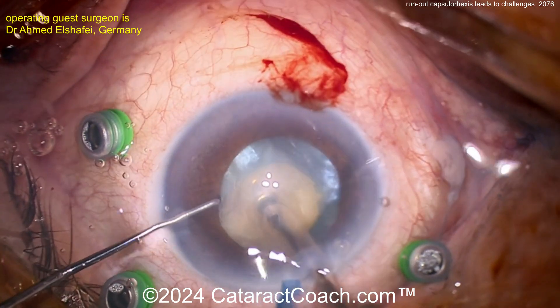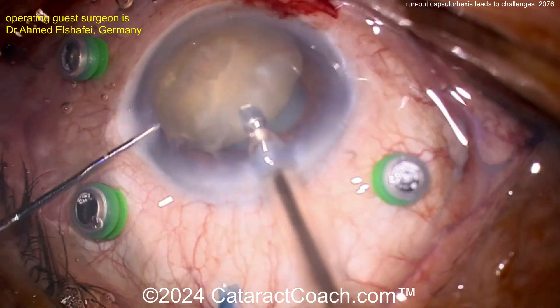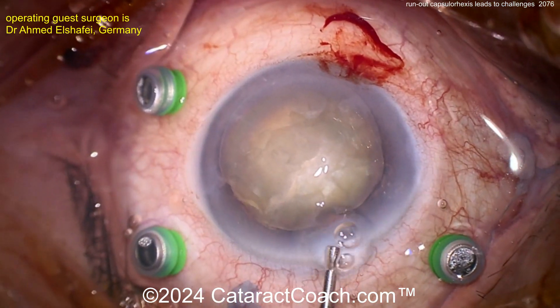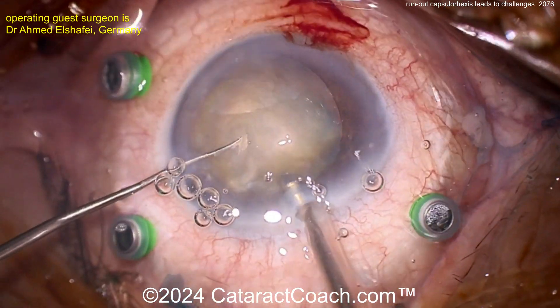It's very tough. Bringing this out of the bag is going to cause some capsular rips, but there you go — the whole nucleus is now up in the anterior chamber. Protecting the endothelium: some viscoelastic behind it, viscoelastic in front of the nucleus.